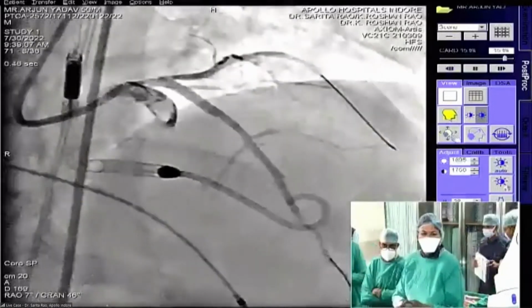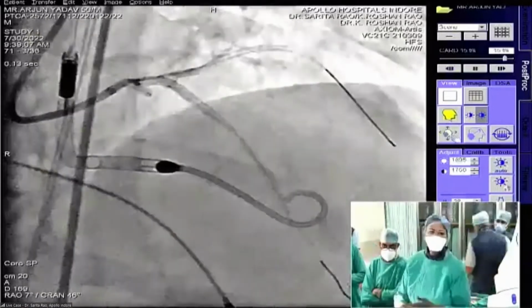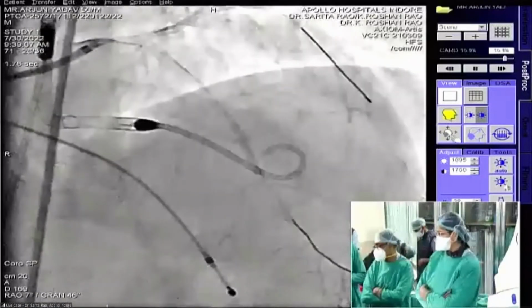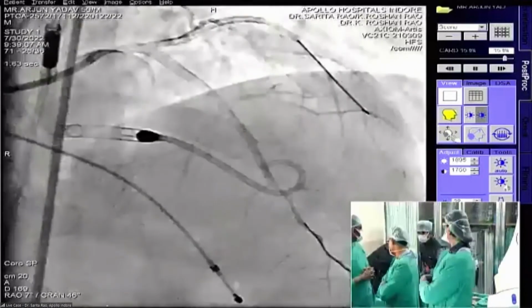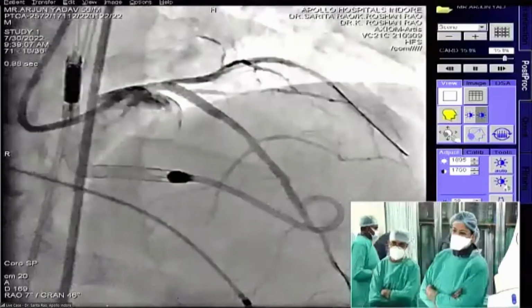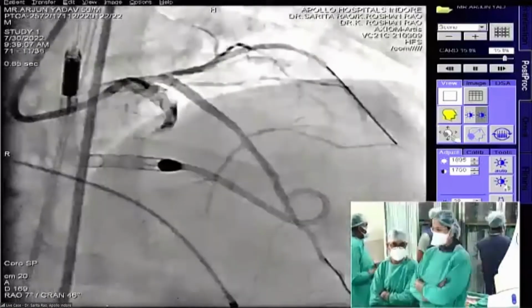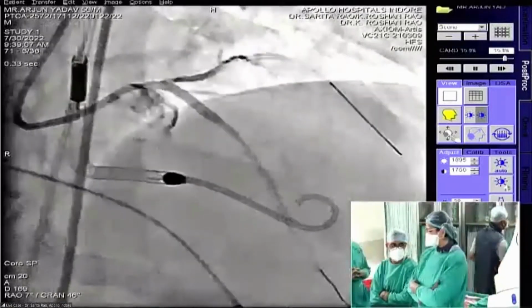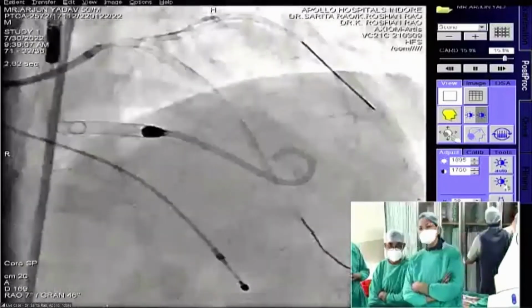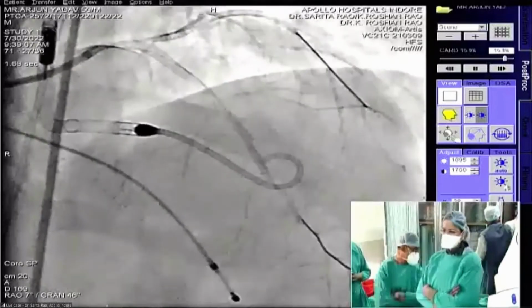Here, as you covered right from the ostium, I think you can be a little aggressive and take a little bigger balloon also and dilate it well. Because the LAD area looks bigger, and the left main area, even angiography-wise if not by OCT. OCT also, I felt the left main area is still slightly underexpanded. I think you can attempt one more bigger size balloon and do part of the left main.